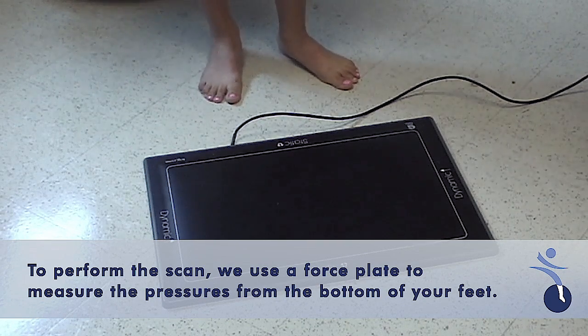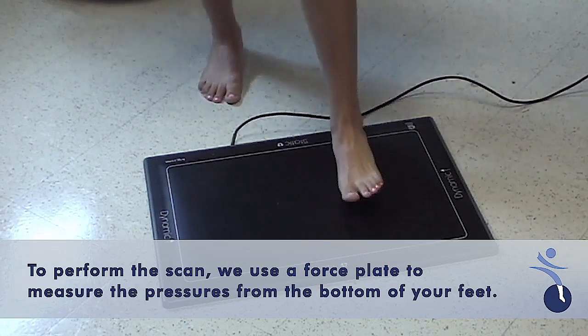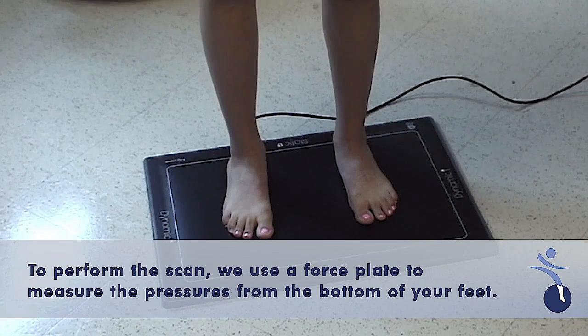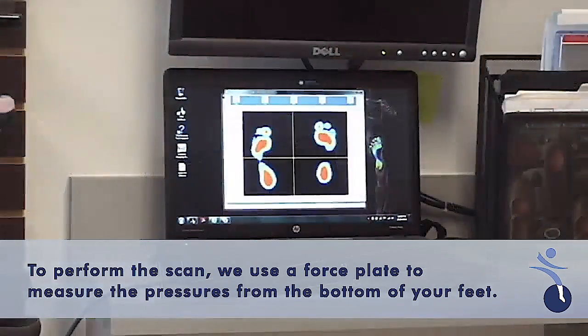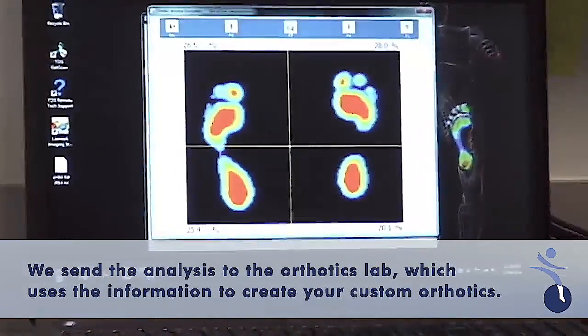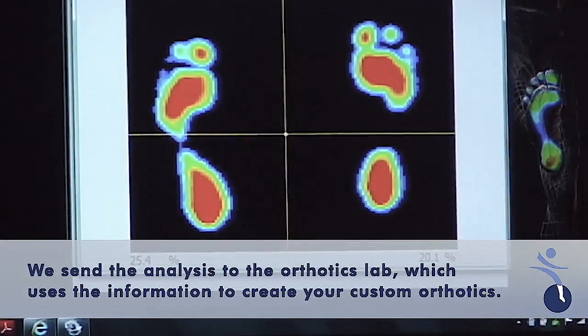Go ahead and step right in the middle of the box with both feet. I'd like you to stand just like normal — nice and relaxed, feet shoulder-width apart. What you're seeing on the computer screen is your gait scan, and this is what we send off to the orthotic group to make your custom inserts.